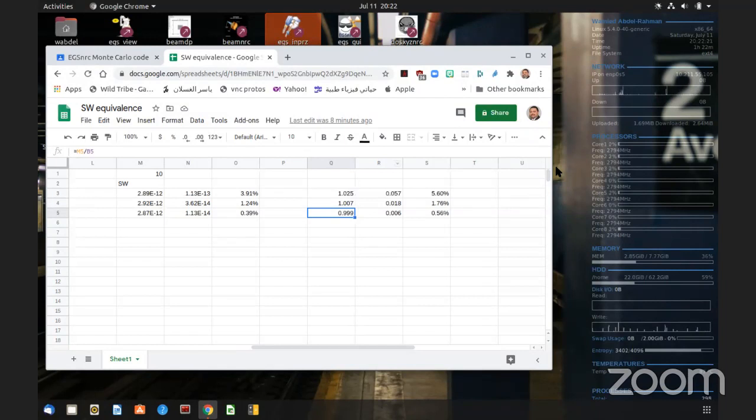Yeah. And what if it is electrons rather than photons? Electrons, you have to investigate. I don't know. What you need to do, I think for electrons, you have to look at 2 things. You have to look at the relative PDDs. Are they the same or different? And you also have to look into the dose. And I think for electrons it is a bit different.